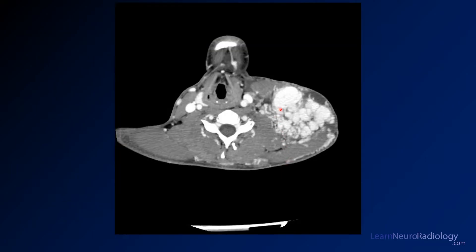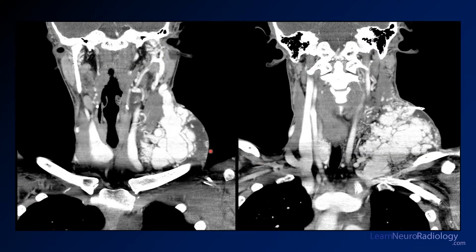Here I'm showing you these images again. You see this cluster of abnormal vessels over here in the left neck. It was notable because there was a palpable abnormality marker, but this lesion was definitely palpable on its own. You see it's opacifying very similar to the arteries in the neck. On the coronal, you see a large tangle of vessels — a lot of vessels with not a lot of intervening soft tissue, just essentially a huge tangle of vessels.